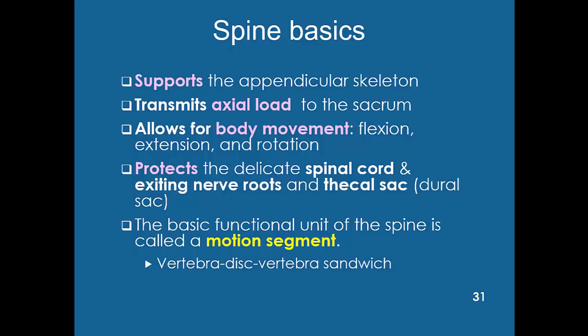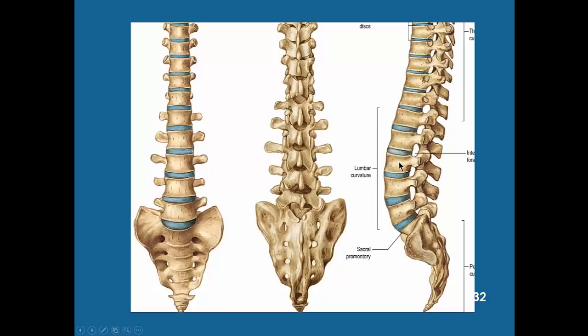A motion segment is a vertebra-disc-vertebra sandwich. Here's L3 vertebra, the L3 disc, and the L4 vertebra — specifically the vertebral bodies, but don't forget the rest of the vertebra in the back. Here's an AP view and a PA or posterior-to-anterior view — also called coronal images, which is a view from the front. A lateral view is also called a sagittal view. There's the auricular surface of the sacrum meeting the auricular surface of the ilium — that's the SI joint.